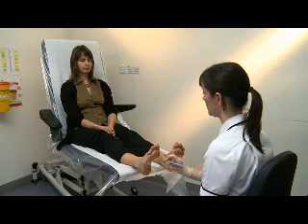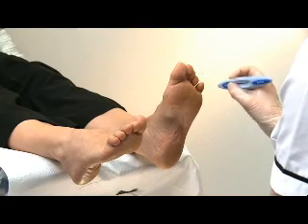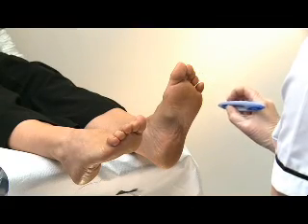The patient should have their eyes closed and respond yes each time they feel it on their foot. Yes. Yes. The total time from contact to removal of the monofilament should be approximately 2 seconds in duration.